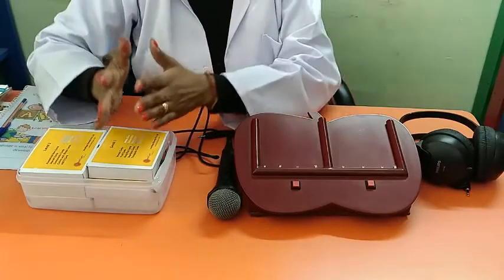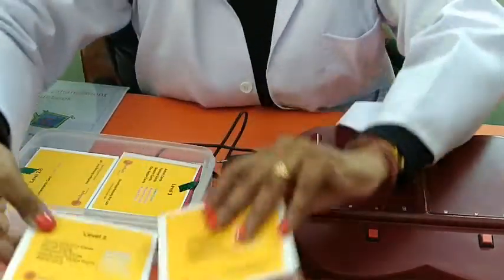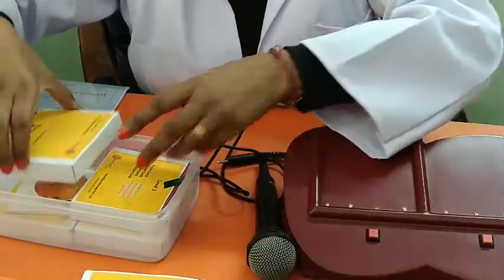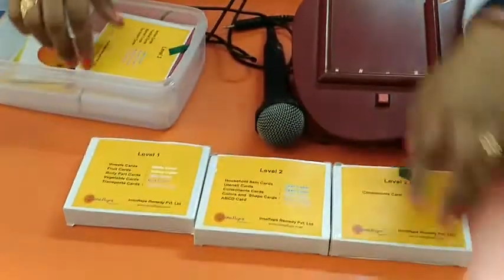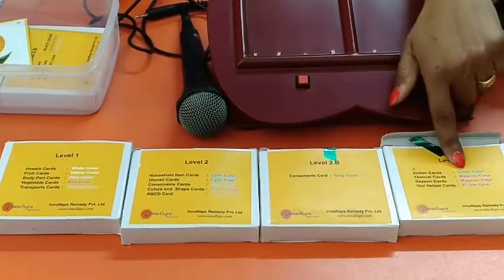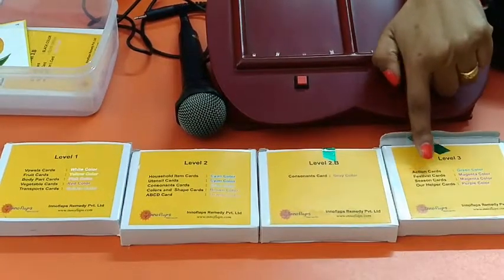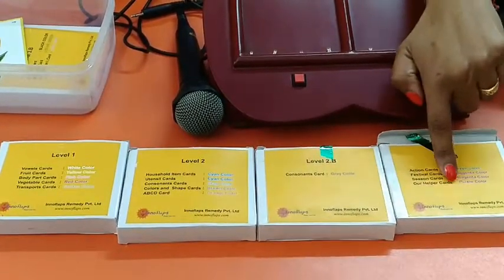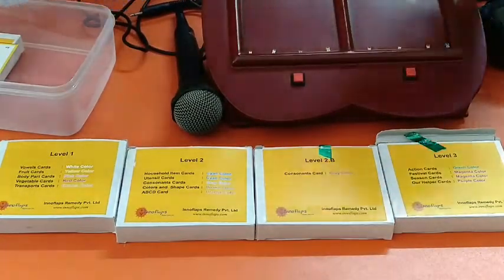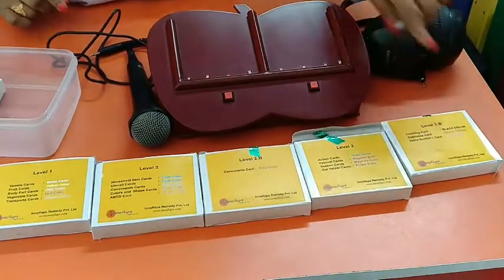We are providing systemized level-wise design cards. We have all the word categories: Level 1, Level 2, Level 2B, Level 3 which has action cards or daily routine cards, grammar cards, festival cards, season cards, and helper cards. Level 3B has counting cards, opposites cards, and home sections.